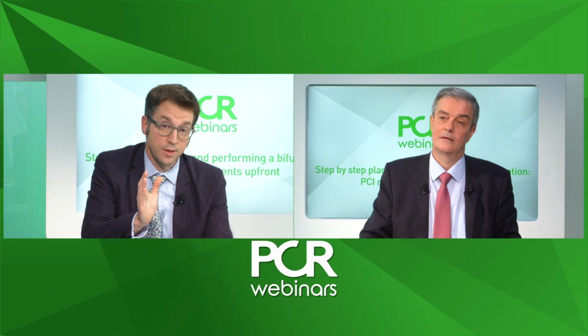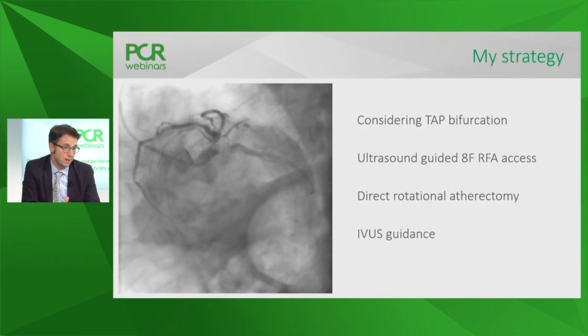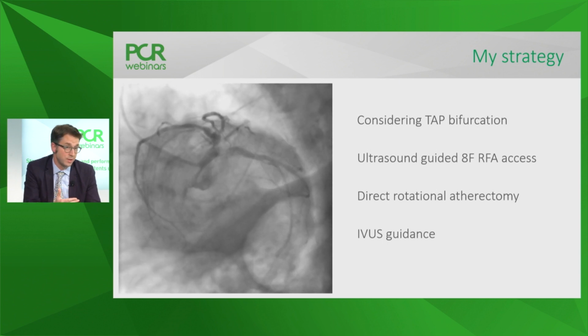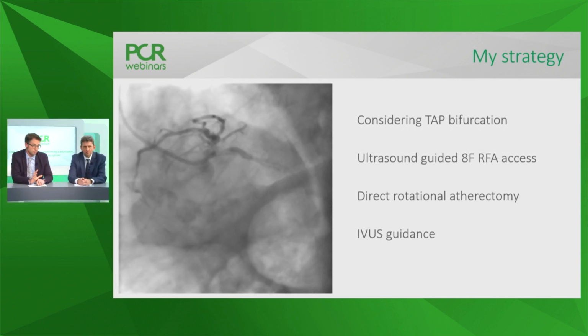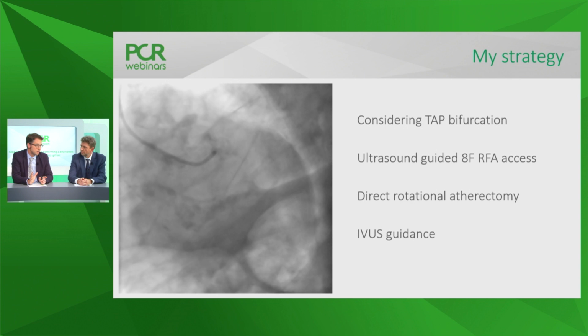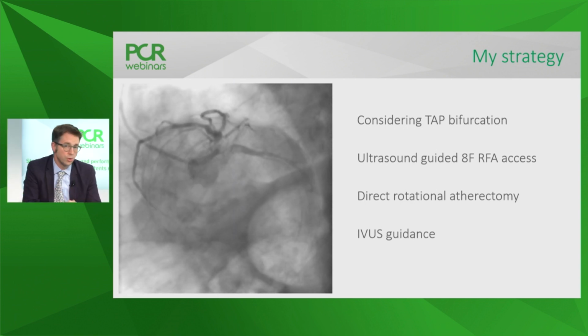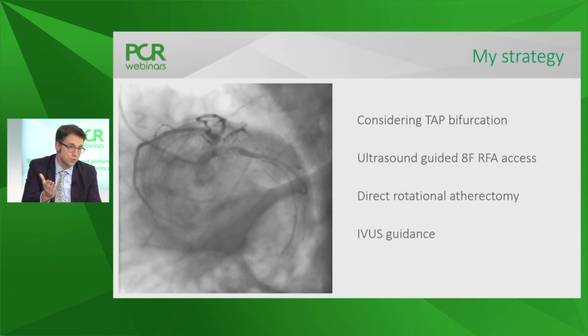I'm going to show you very shortly why that might not be an option. I think looking at this picture we have now on the screen, you could argue that's a valid approach. But I think what we're underestimating is the extent of the disease extending back into the left main stem. And so the V-stent is one. There's the extended V, or the Helqvist, which would be to stent the left main so you protect the proximal main vessel and then deploy your Vs. And that, for me, really is probably a safer approach than V if that were the way that you're passing. But there are clearly lots of options, and there are pros and cons for every strategy.